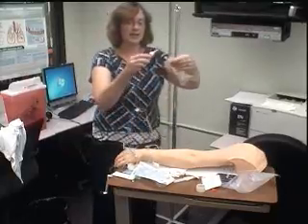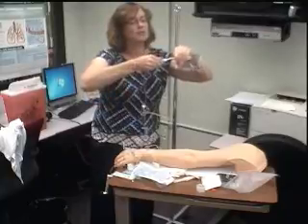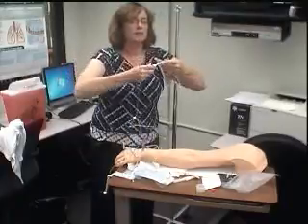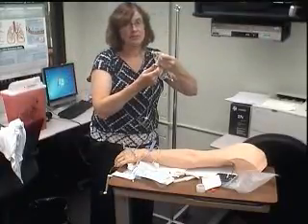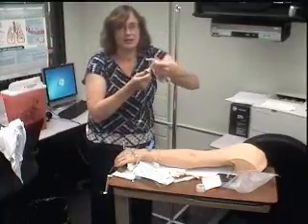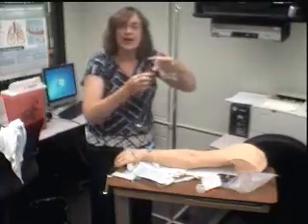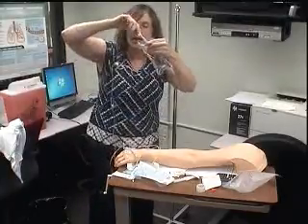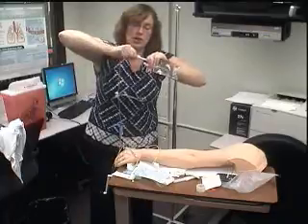Now I need to connect this to this. So this here, I'm going to spike the tubing by pushing it in. Sometimes you have to push a little harder than you think. And be careful that you're not bending like this. I can tell you I've done that before, and it's not a pretty sight. I just admit this, I did it to blood and I ruined a whole bag of blood. I was in such a hurry, I had it bent, and I poked right through it. So if I can give you any warning, keep it straight while you're twisting and turning and pushing so that it goes up to where it needs to go.